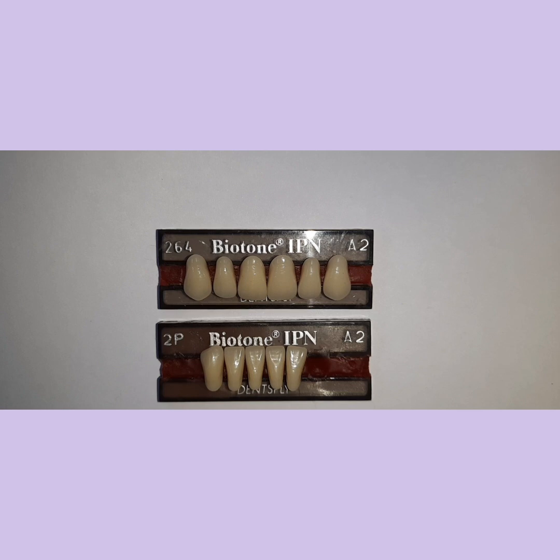They are self-adjusting and self-polishing. Polished shape and form cannot be maintained during trimming, so when you are trimming, you have to be very careful not to trim in such a way that they lose the shape and contour of the teeth. The wear results in loss of vertical dimension.